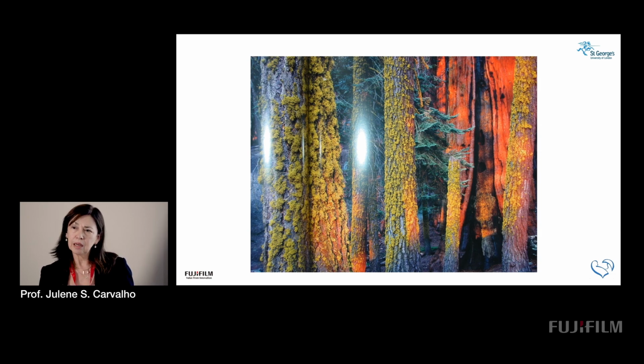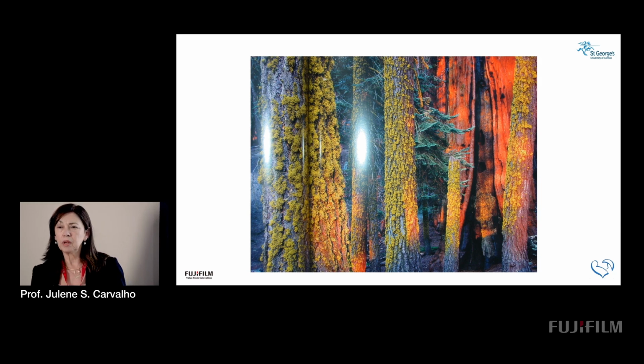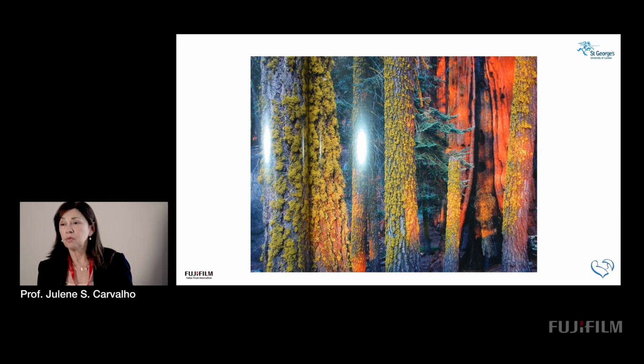Color can add a lot of information, and although that's not part of cardiac screening from the ISUOG guidelines, a new revised version will strongly recommend the use of color. So I think to use that, we need to know how to use it and how to interpret the information.